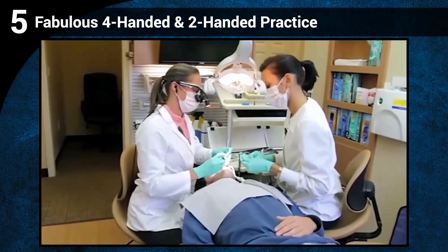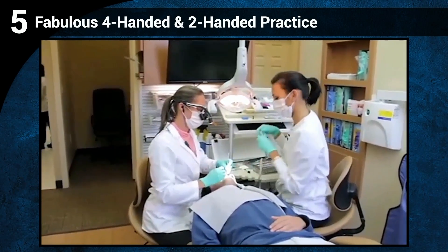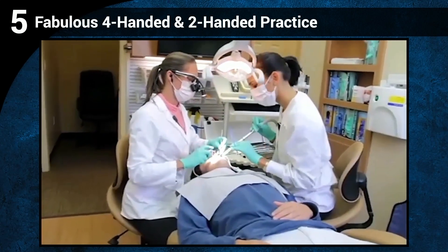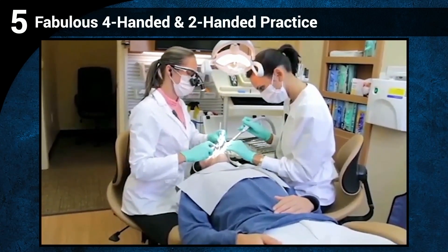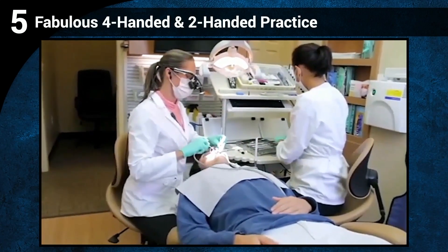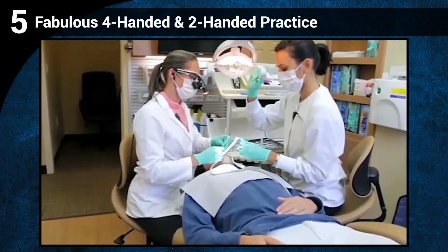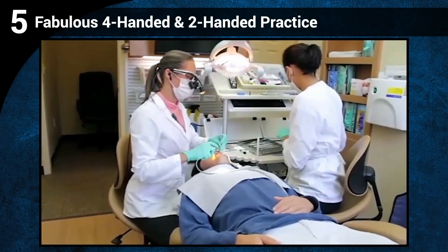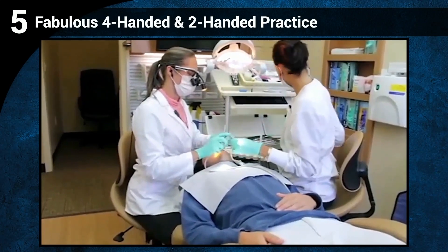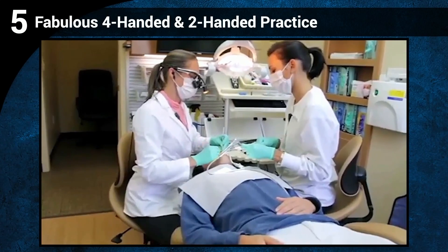Let's take a look. Amanda, the assistant in this situation, is almost six feet tall, so she's actually at a slight disadvantage compared to a more traditional assistant — you can see her tipping a little bit; I'd like to see her a little further in. But you can see that the doctor is able to continue to produce seamlessly because the assistant never needs to leave the field to obtain whatever supplies are necessary.